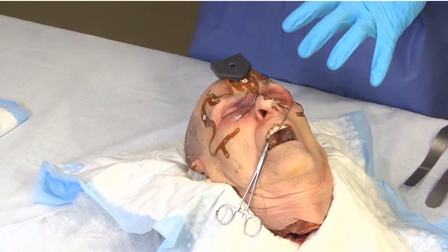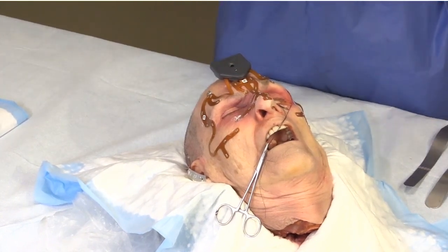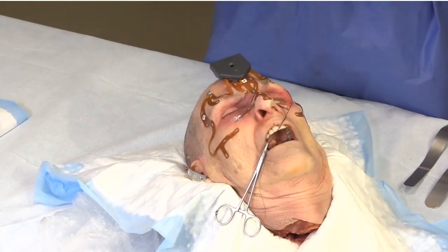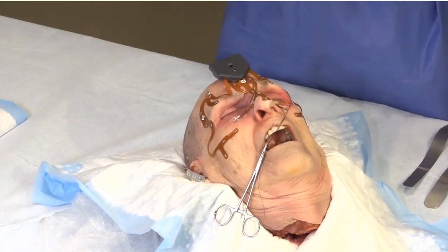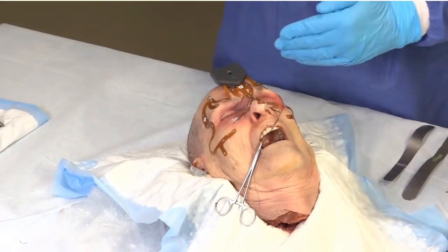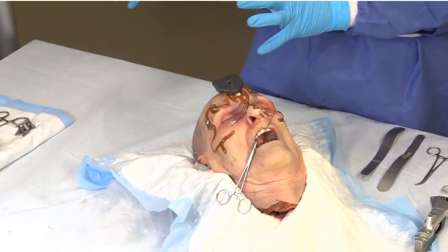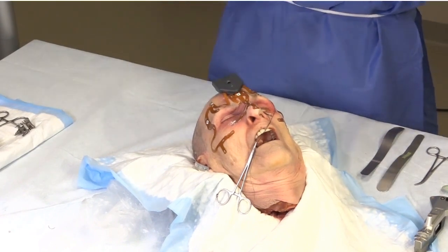You're going to want your CT scan to be taken after the patient's swelling is gone. Think about how that scan is done — most hospitals will now have some kind of navigation protocol CT. In our hospital, I ask for a Stryker navigation protocol CT, which is a simple non-contrast CT running all the way to the top of the skull and down through the maxilla and mandible, so I have all this anatomical detail available for my registration.